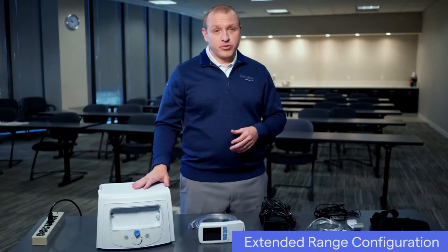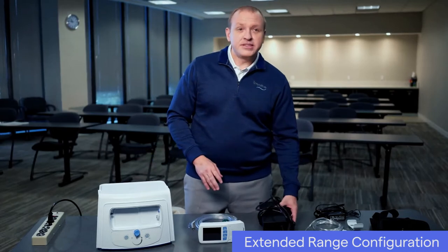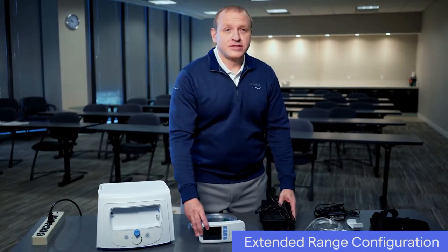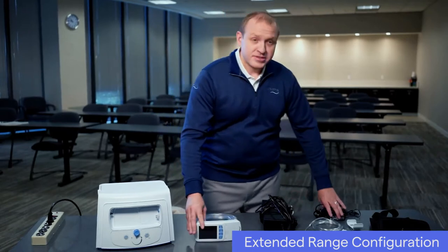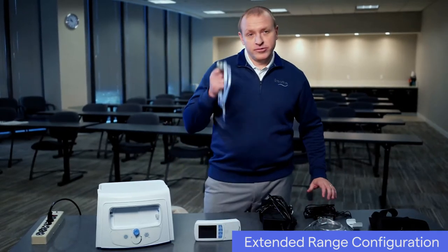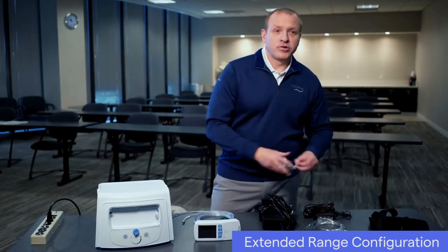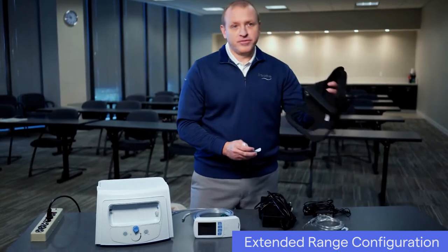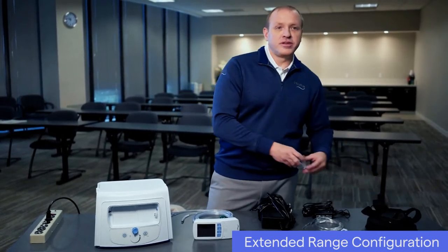Here are the components you'll need to set up the LIFE 2000 ventilation system in the extended range configuration: the LIFE 2000 compressor, the compressor's AC power cord and external power supply, the LIFE 2000 ventilator, the ventilator's AC power cord and battery charger, the Combo 2 hose, a belt clip or carry case for securing your ventilator, your interface — the breathe pillows and entrainment interface.